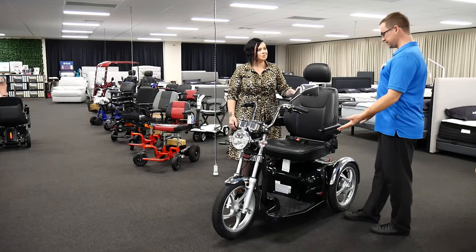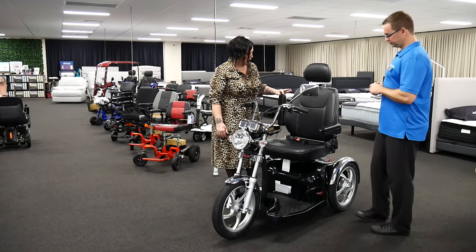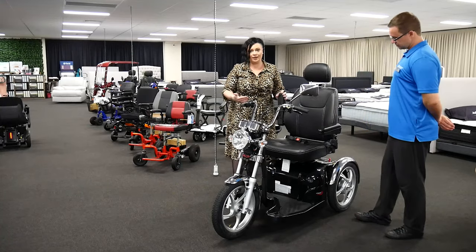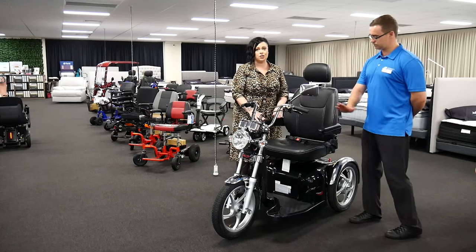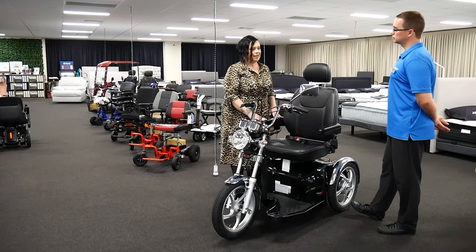What are some of the great features you usually tell people about with this model? The removable arms that can come up and down — so side transfer isn't an issue if you're needing to side transfer. We've had a client come in who was wheelchair-bound as an amputee and he was able to transfer directly over, which was a really big positive.